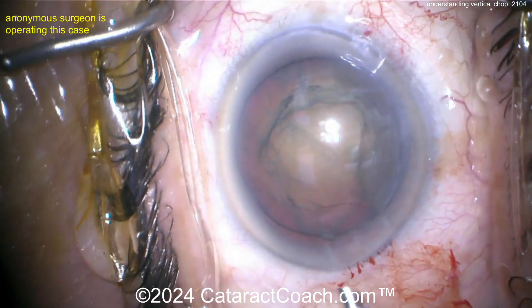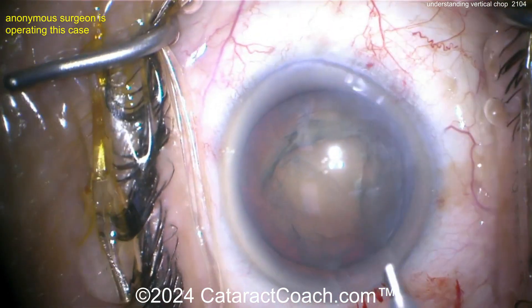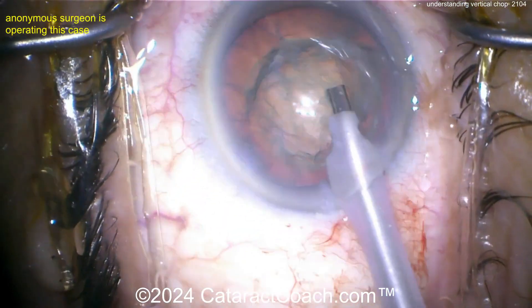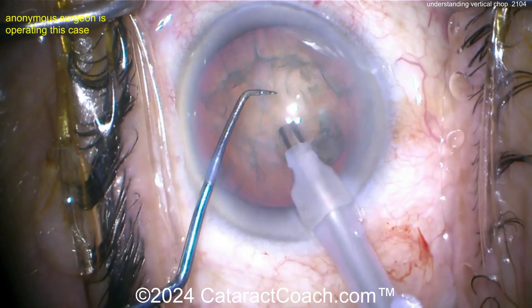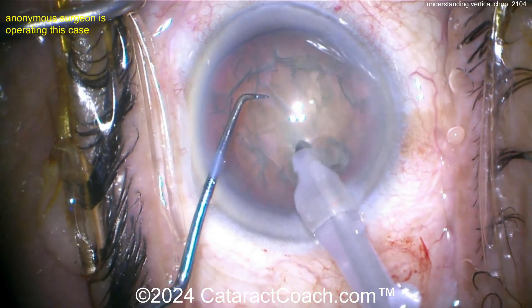Here comes the phaco probe. For settings, you want high vacuum — three, four, or five hundred millimeters of mercury — with a flow rate of about 35 cc's per minute, and enough phaco power to get the probe embedded. The phaco probe goes in bevel down, aimed right in the middle of the nucleus, nice and deep.